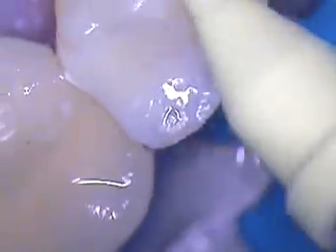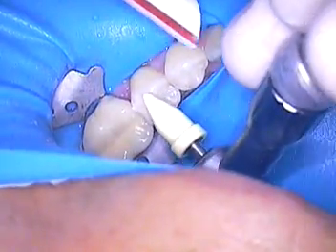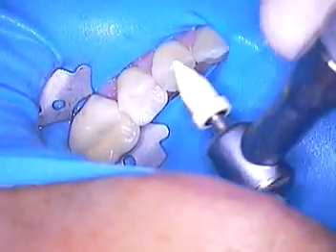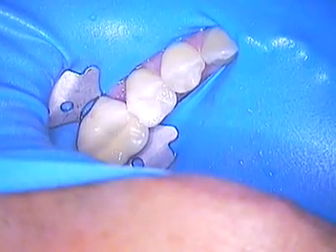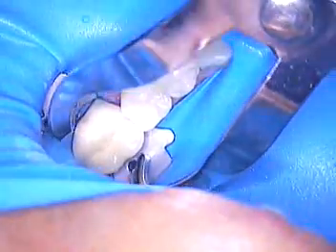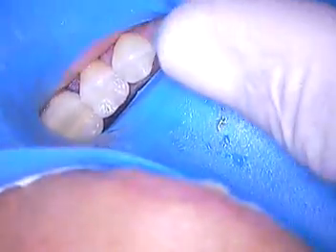At this point we can get our rubber dam off. I'll need a pair of cotton pliers. Looks like we already got the floss out of there. Our tethering floss is removed. Now we need the clamp holder. I always like to instruct my patients: don't close right away after the rubber dam's off, because we want to rinse thoroughly.